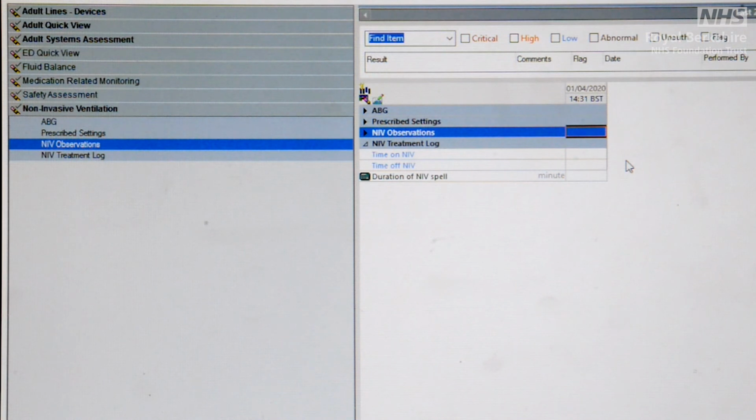This will be used in determining how well the patient is tolerating the non-invasive ventilation, but also around whether we would need to escalate the support that they are receiving in terms of the IPAP and the EPAP, or whether it be that actually we need more sustained periods of time on the non-invasive ventilation in order to actually achieve better patient outcomes and start to see improvements in respiratory function.